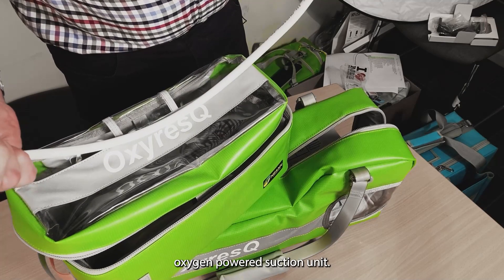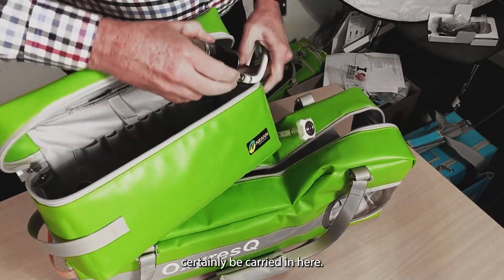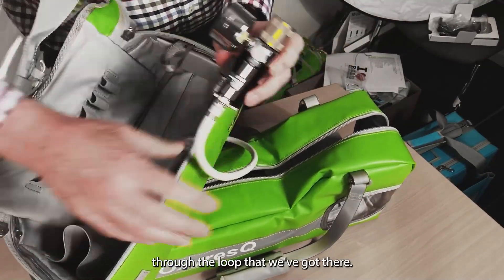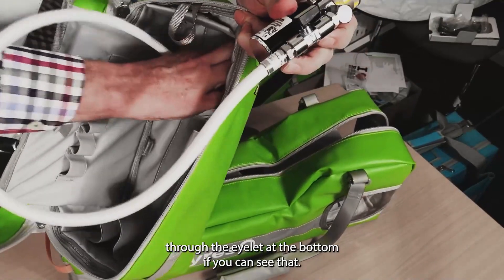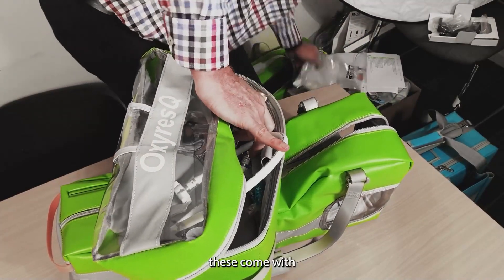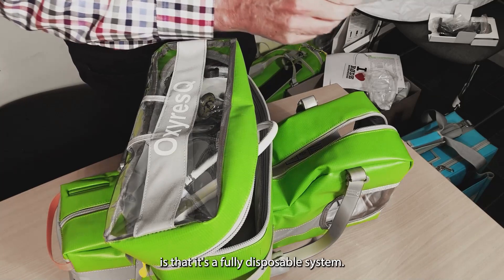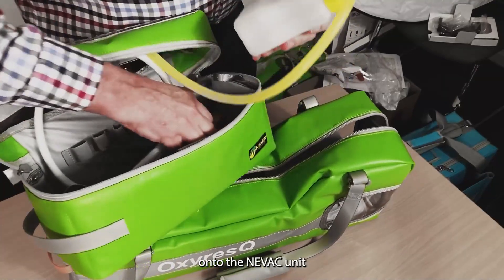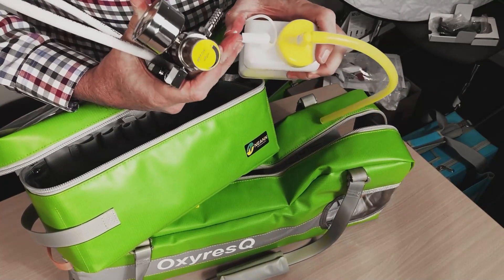That's our NEVAC oxygen-powered suction unit — it will certainly be carried in here, sitting in this compartment through the loop. The hose connects through the eyelet at the bottom and goes into the pouch. The neat thing about the NEVAC is that it's a fully disposable system — the collection canisters connect onto the unit, and when you have aspirant in there, you simply put the lid on and dispose of it safely.